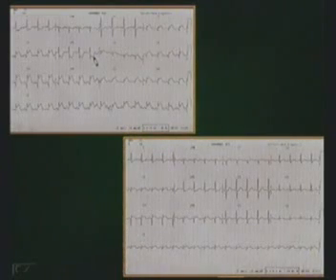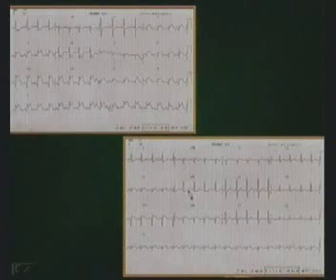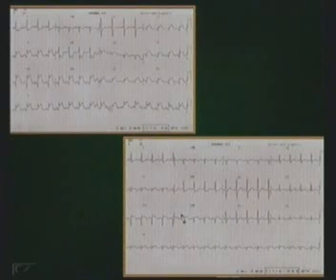As you see here, we have the acute, hyperacute ECG, and the same ECG after it settles down. So the ST starts coming down, the Q wave forms and the T starts inverting. Finally you are left with the Q wave and probably an inverted T wave. So this is the regular evolution of an MI.